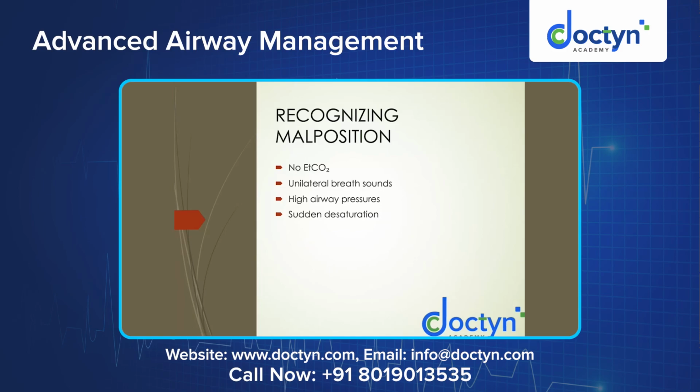Proper ventilation would show ETCO2. So if there is no ETCO2, the tube is not in the right place, it would be too far outside. Unilateral breath sounds mean it is too far inside. High airway pressures, again it is too far inside. And desaturation, it would be inside or outside as well. Any which way there would be desaturation.